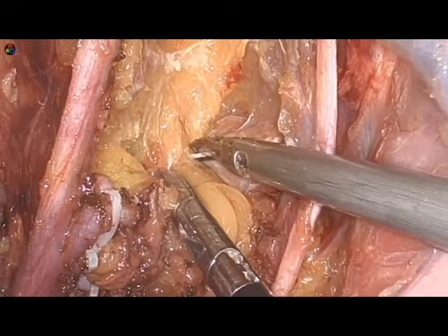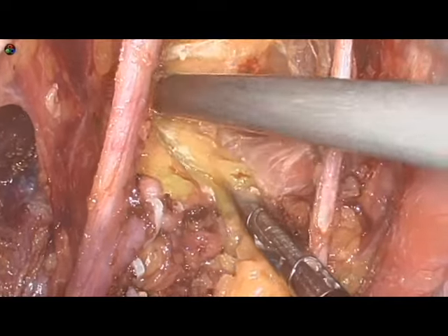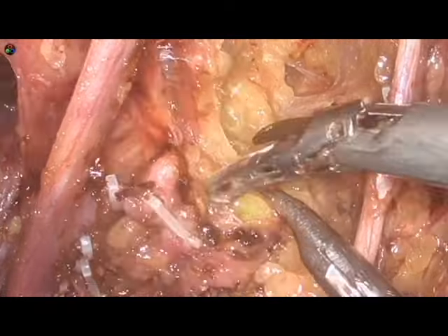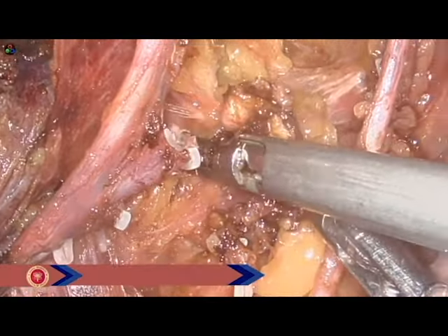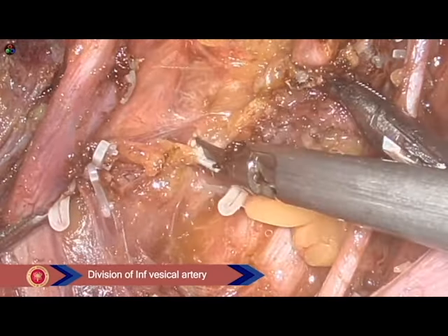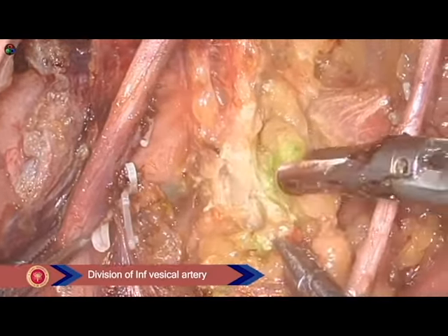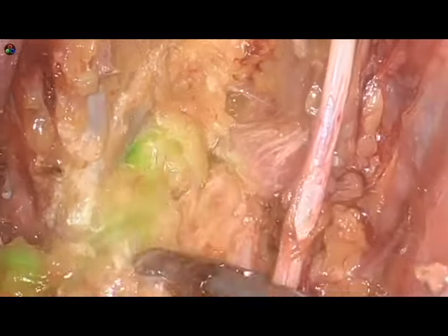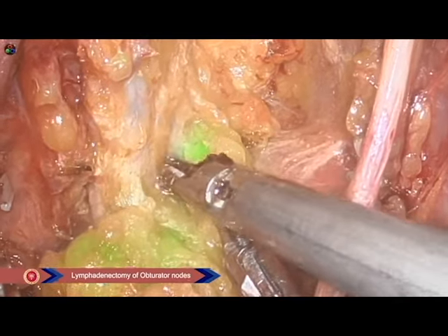The inferior vesical group form one of the most common sites of recurrence after suboptimal pelvic lymph node dissection. Care must be taken to remove this group of lymph nodes meticulously. For a thorough clearance around the inferior vesical artery, it can be safely ligated without compromising the bladder vascularity. The ICG mode was frequently used to identify the location of this lymph node. This increases the lymph nodal yield and ensures completeness of dissection.